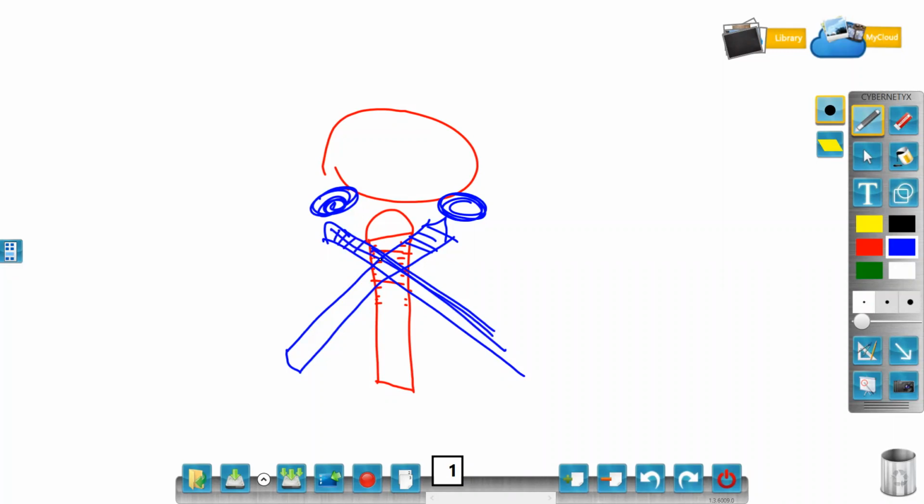So whenever you are inserting the probe, you are tilting it this way and this way, thinking that the ovary has a fixed location. Does the ovary have a fixed location? A big no. Then why are you expecting the ovary to be exactly at that point where you always think it to be? The ovary can be somewhere here high up, over here, or maybe over here. Then your probe has to be this way.